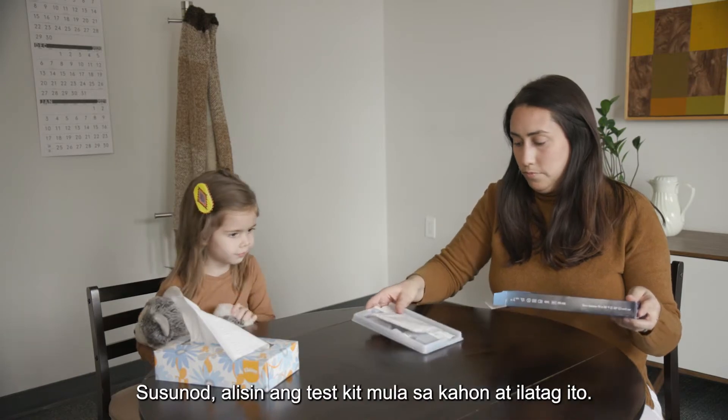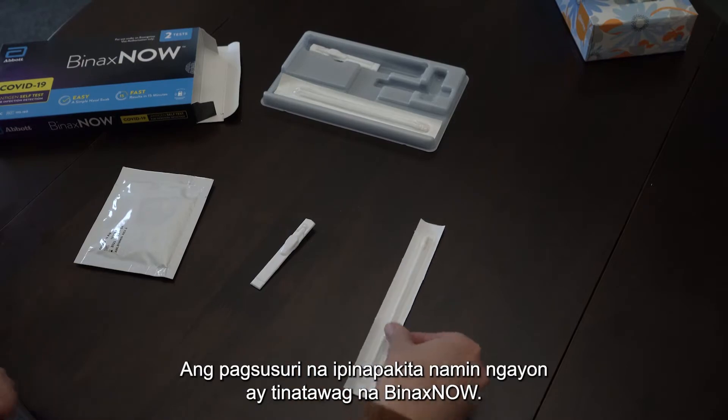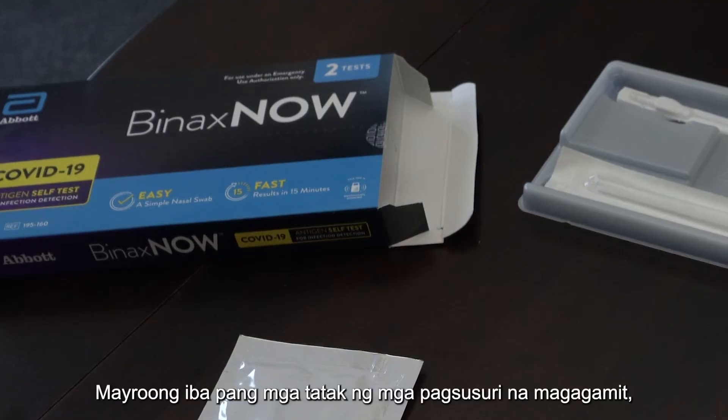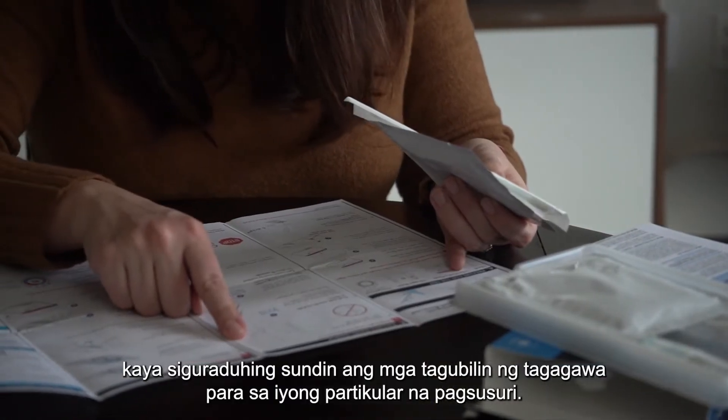Next, remove the test kit from the box and lay it out. The test we're showing today is called Binax Now. There are other brands of tests available, so be sure to follow the manufacturer's instructions for your specific test.